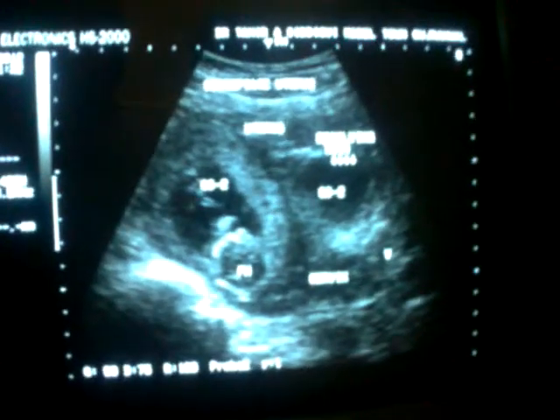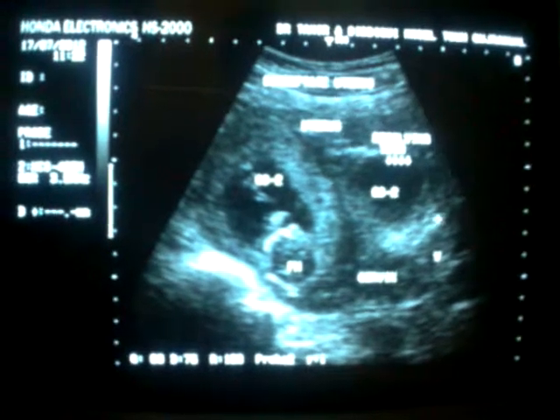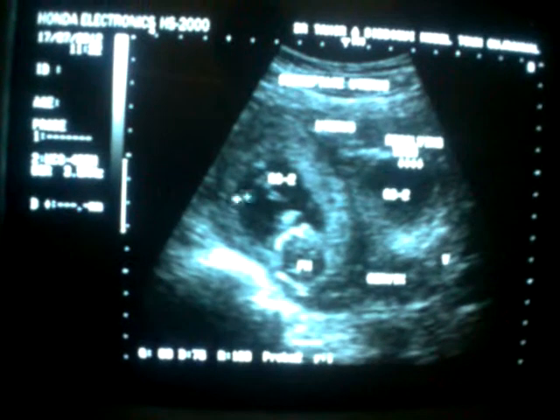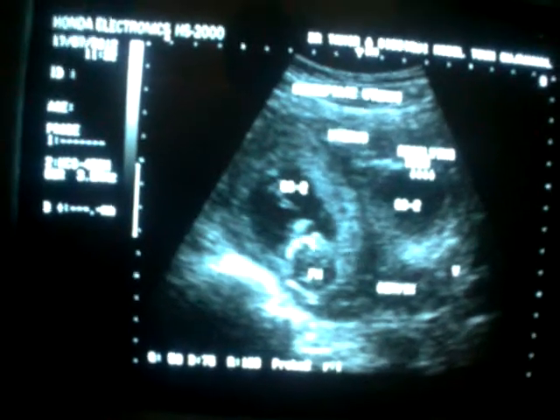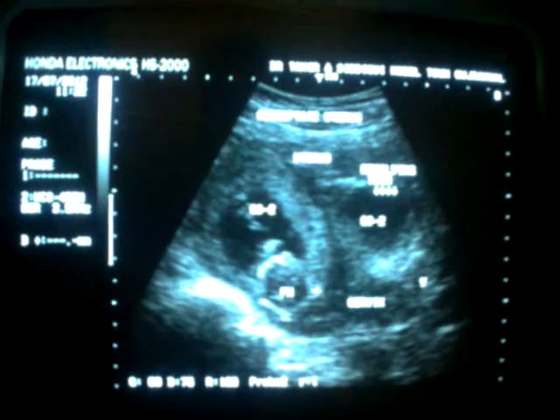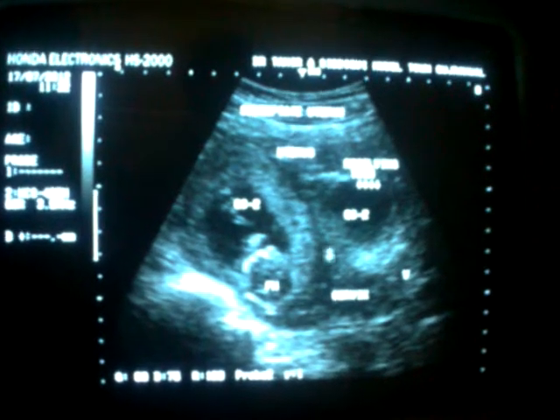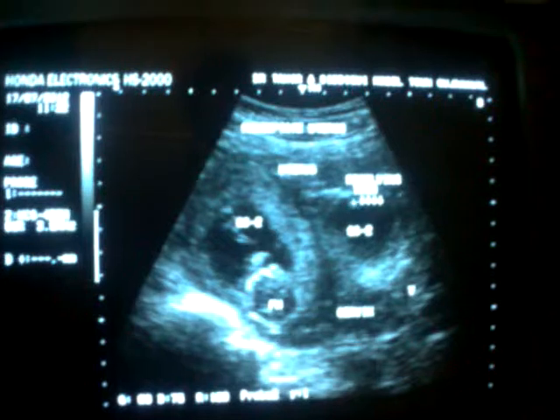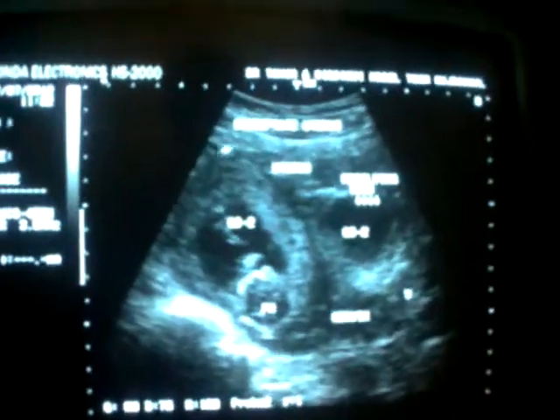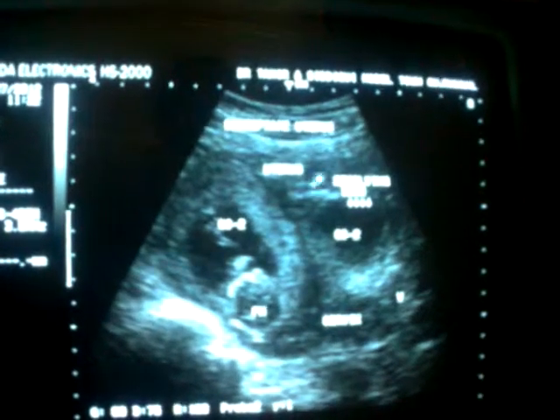This is an ultrasound of the subseptate uterus. You see the uterus, all of this, the total is all uterus. Now, the cervix and vagina are single, the cervix is single, and there are two cavities seen within the single uterus. This is a subseptate uterus because no indentation is seen at the fundal region.